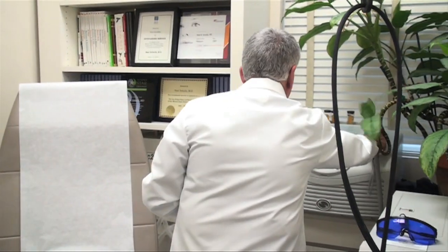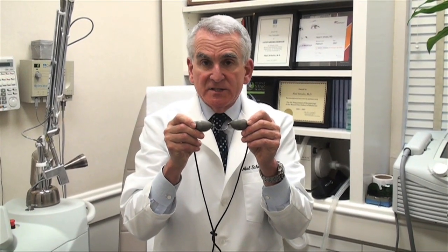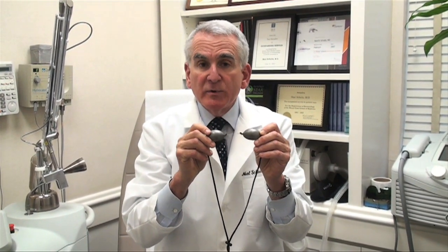Whenever we do a laser procedure, we need to protect the patient's eyes. The patients get these completely opaque glasses — this is actually metal and non-reflective — that they wear to protect their eyes from any stray laser energy. And last but not least, I need to protect my eyes as well. These are the glasses that I wear during laser procedures, protecting my eyes from the laser energy while still enabling me to see the patient. So that tells you a little bit about the lasers and laser treatments we talk about. I'll see you tomorrow.